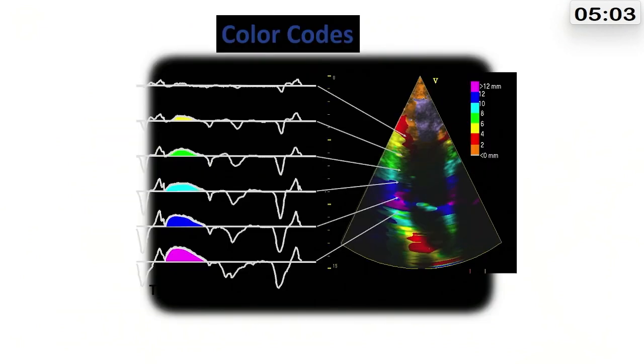On the right-hand side, you have 12 down to 0, where 0 is no movement, so 0 gets the orange, i.e., when you are at the apex, you move 0 towards the apex. When you are at the base, you move a lot towards the apex, so you get this color, which is 12. The idea is very simple. It's moving in that longitudinal direction, which your eyes can't see, but the computer can get it for you. It is very reliable, does not depend on you but on the computer and AI.